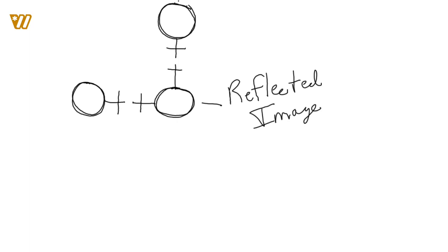So what you're doing is, whenever you're moving the dials, you're actually moving this circle in and out so that these two crosses overlap. Right? And the same thing's here. Whenever you're moving your horizontal dial, what you're doing is you're measuring the horizontal size of this reflected image, and you're moving your cross in and out so that they actually overlap each other. Whenever they overlap each other, horizontally and vertically, then what you're actually measuring is the size of that reflected image.